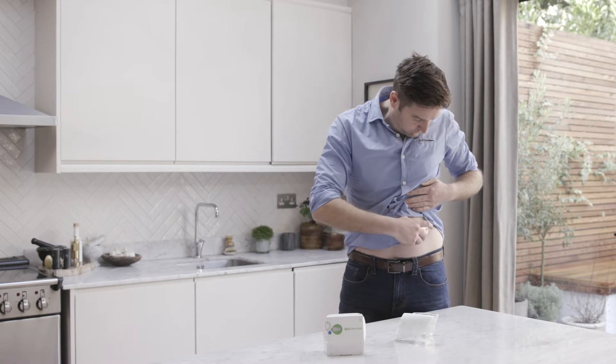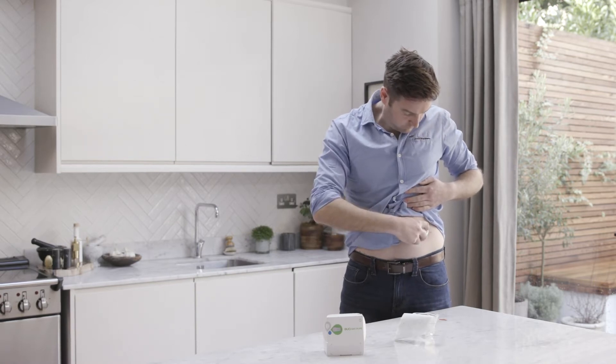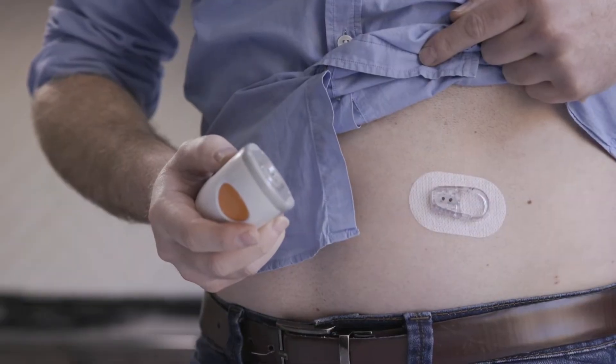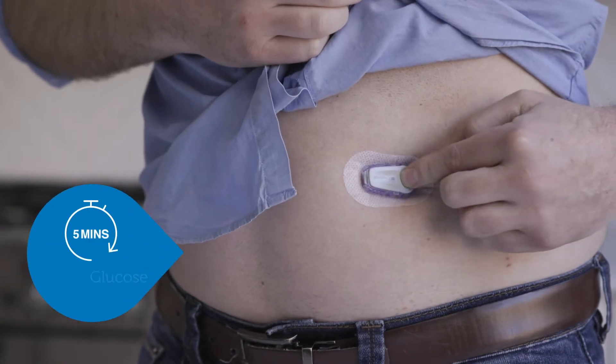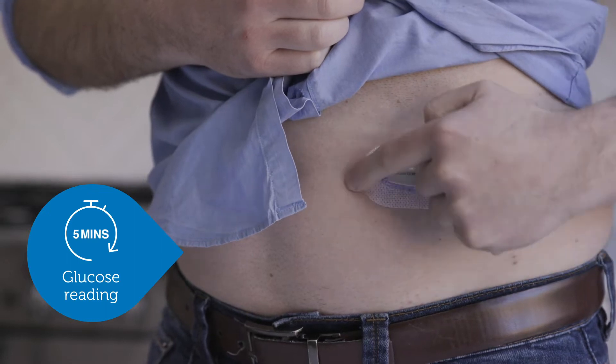The sensor applicator inserts the sensor just beneath your skin. The sensor then measures your glucose levels for up to 10 days. Once the sensor is inserted, the transmitter is clicked into place and sends glucose data to your Dexcom One app every five minutes. Your transmitter lasts for up to three months.